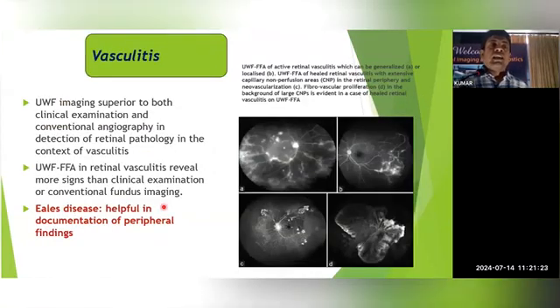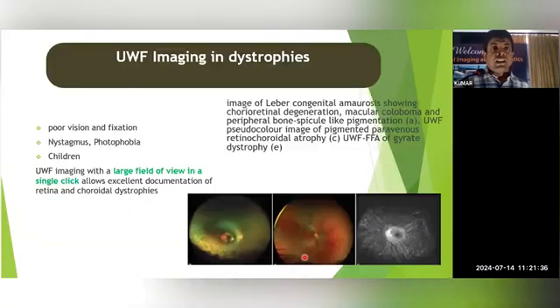Similarly, in vasculitis, like I was discussing about retinal vein occlusions, again, Eales disease and another retinal vasculitis like tuberculous vasculitis, in most of these cases you can easily pick up the CNP areas and laser them, and then you can follow up these patients easily.